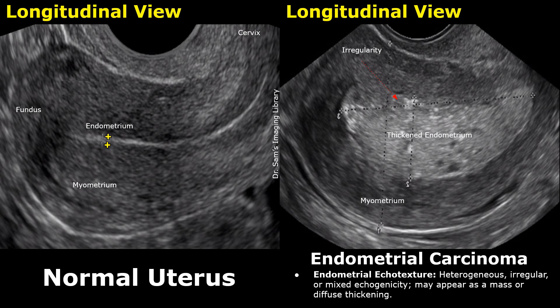Hello everyone, this is Dr. Sam and today we will learn about endometrial carcinoma on ultrasound. Endometrial carcinoma is the primary malignancy of the endometrium and it is the most common gynecological malignancy. On ultrasound, it has some overlapping features with endometrial hyperplasia, but a few findings do differentiate it. We will compare endometrial carcinoma images with normal uterus ultrasound images for better and easier understanding.